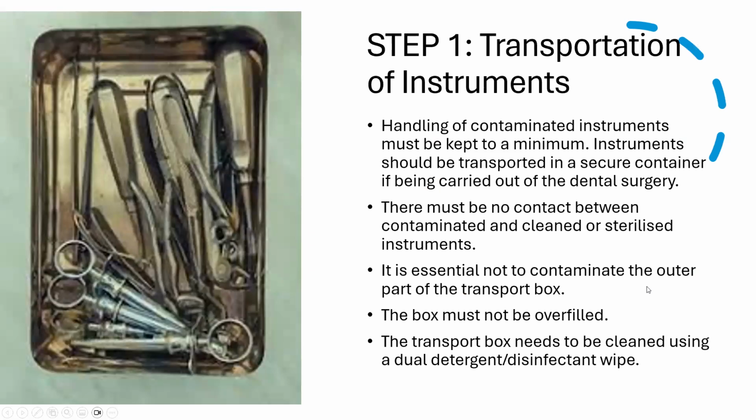Step 1, transportation of instruments. Handling of contaminated instruments must be kept to a minimum. Instruments should be transported in a secure container if being carried out of the dental surgery.